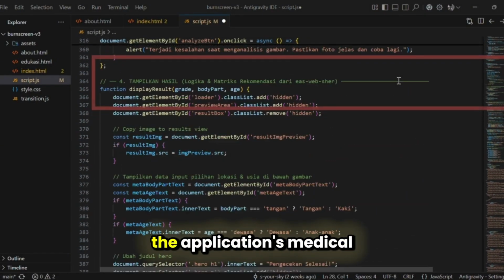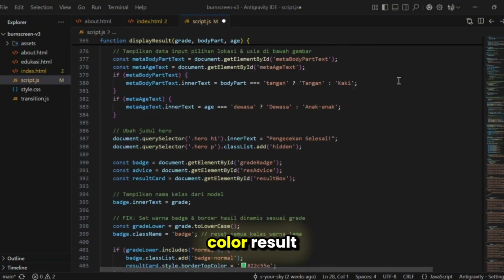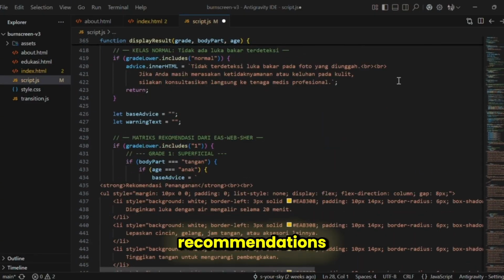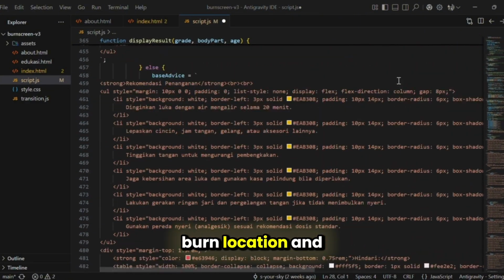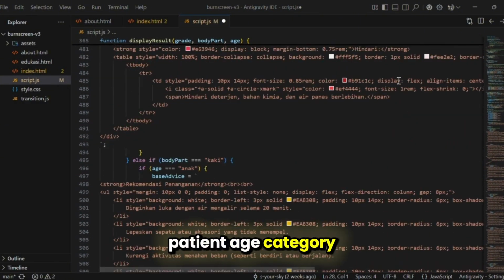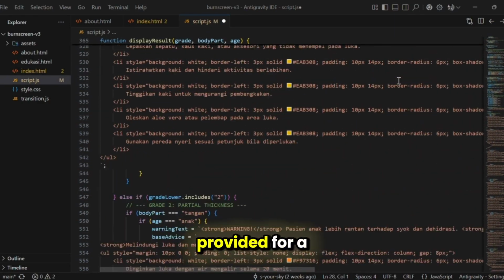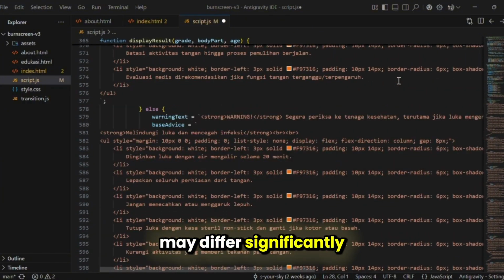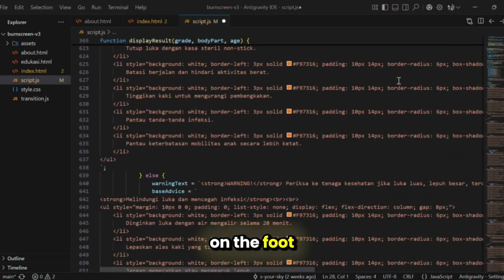Inside this function, the application's medical decision logic is executed. The system dynamically adjusts the badge color, result border color, warning message, and first aid recommendations based on a combination of the predicted burn grade, burn location, and patient age category. For example, the recommendations provided for a child with a grade 2 burn on the hand may differ significantly from the recommendations given to an adult with a grade 1 burn on the foot.